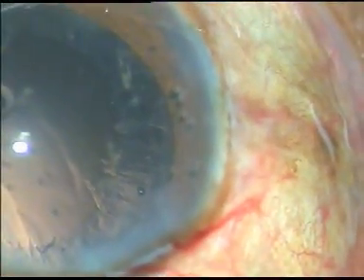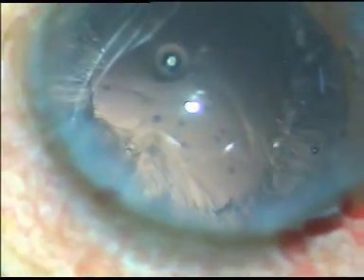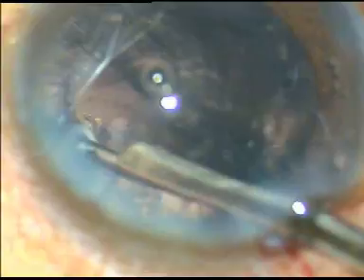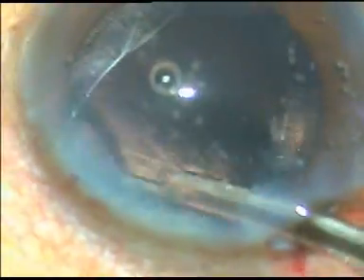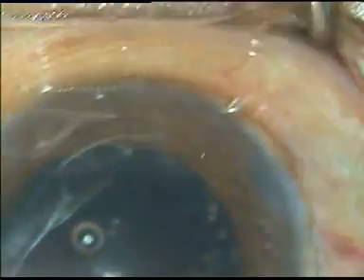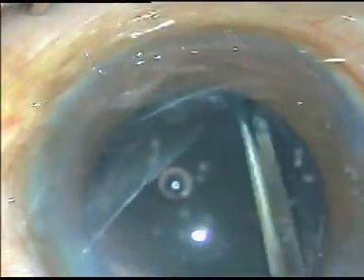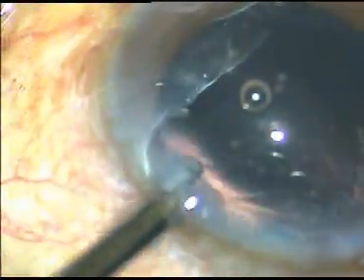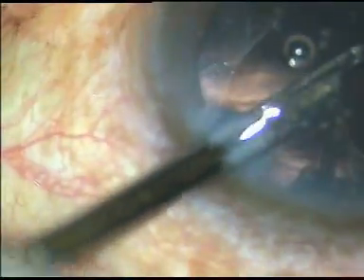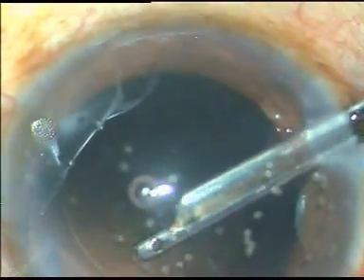I just have to remove the cortical fibers sticking to the equator of the lens. A direct Simcoe cannula is taken and cortical cleanup is done. One can use a bimanual irrigation-aspiration system — I use bimanual irrigation-aspiration probes sometimes — but most of the time this instrument is enough for cortical cleanup. And it is done.